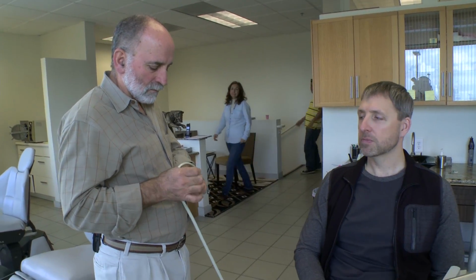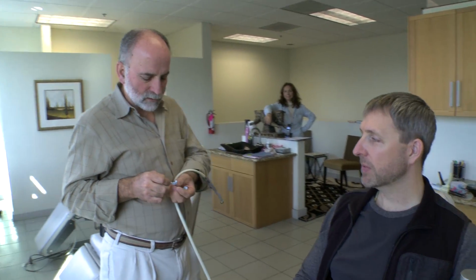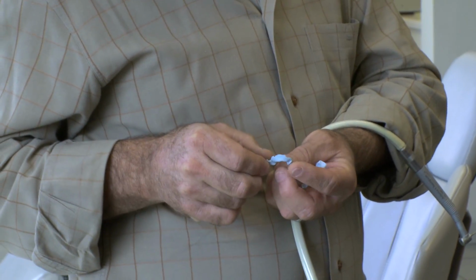Yeah, I'm getting more hitting on the left than the right now. Oh, but my legs are crossed. It's more on the right. Yeah, there's a high spot right here. Feel on the right side. That was left. This is right. Yeah, definitely.